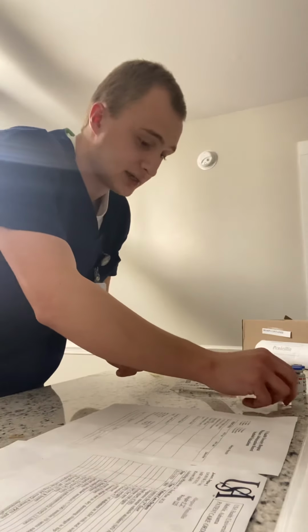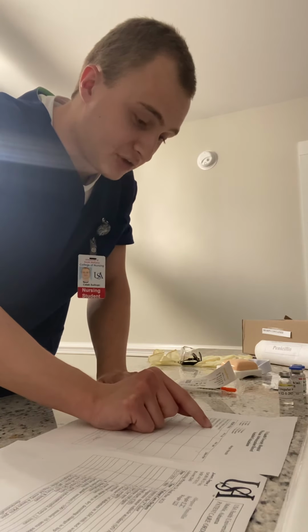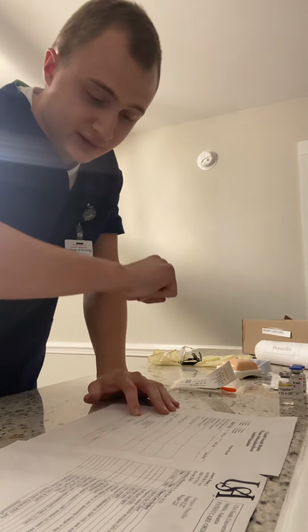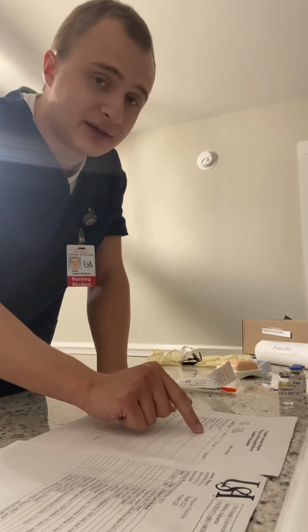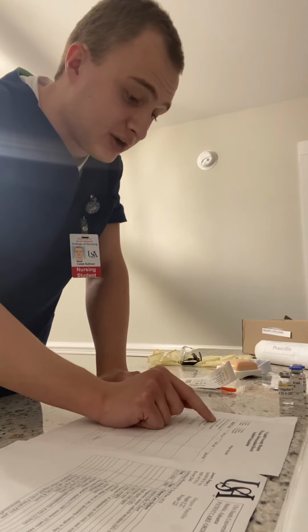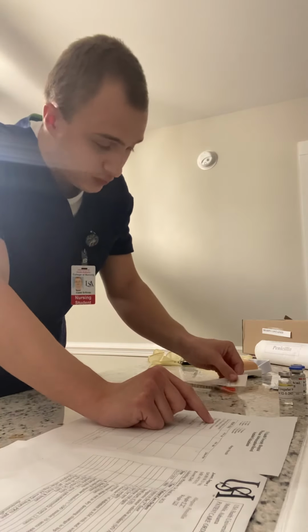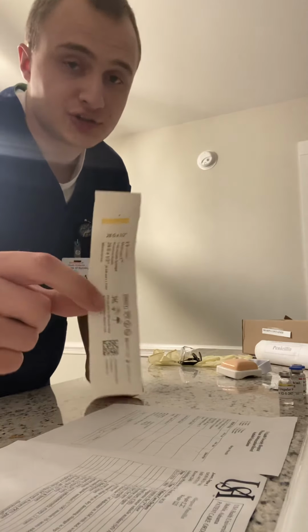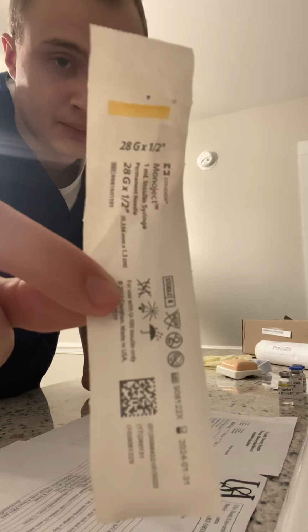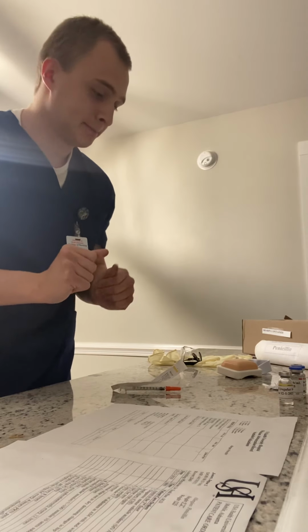Okay. Next thing I'm going to do is verify the right time for the medication, which is 30 minutes before meals, and I can see that it's 30 minutes before meals, and he has not had the medication within the last few hours. Next I'm going to check the right route, which is subcutaneously. And for this subcutaneous insulin injection, I'll be using a 1 milliliter or 100 unit insulin syringe. I'd like to make note that my insulin syringe does not have a safety cap.